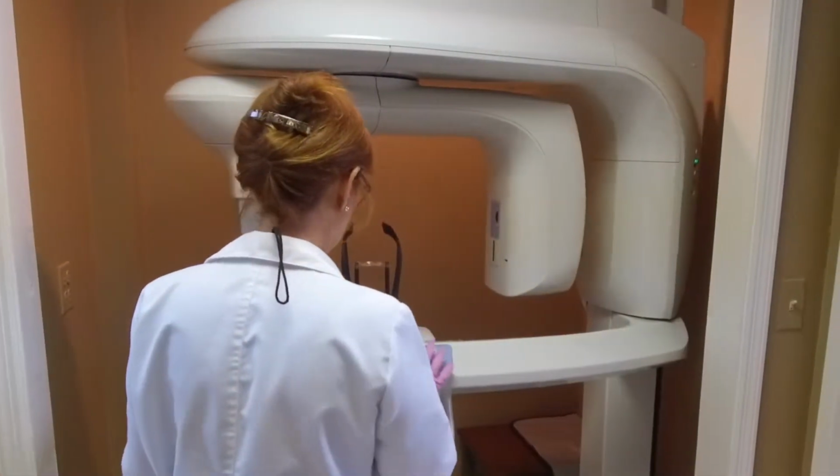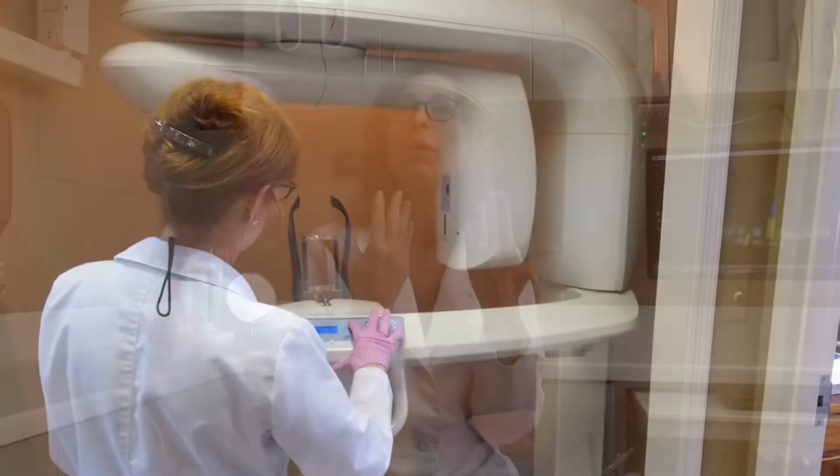So usually we take the tooth out, put some bone particles in the socket, and then let that heal, generally 3 to 6 months, depending on if there's bone loss and how large a tooth it is. Once that heals, we do a 3D scan of your jaw. It's kind of a mini CAT scan, and we can look three-dimensionally at the jawbone. Do we have enough height and width of bone to put an implant in? We look at vital structures, like the nerve that goes through the jaw, or the sinus cavity in the upper jaw, so we make sure that's not in the way of placing our implant.